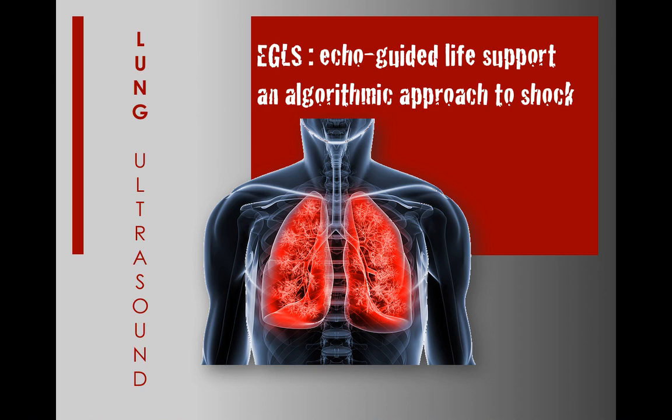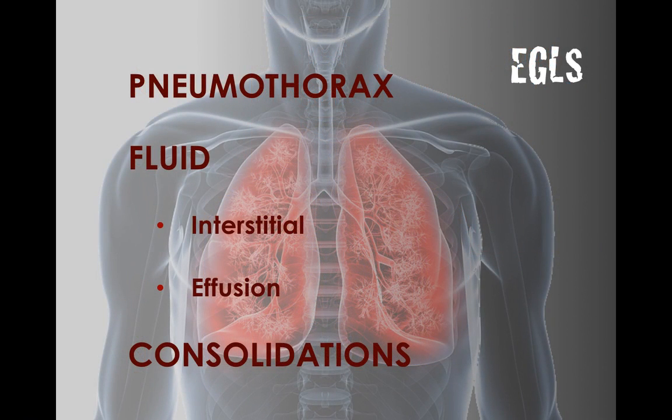Welcome back to this section on lung ultrasound. In this section, we will more specifically look at how to diagnose pneumothoraces, the interstitial syndrome, pleural effusions, and lung consolidations. I guess what you're trying to say is that if we resuscitate patients for a living, this is something we gotta know. Exactly it.